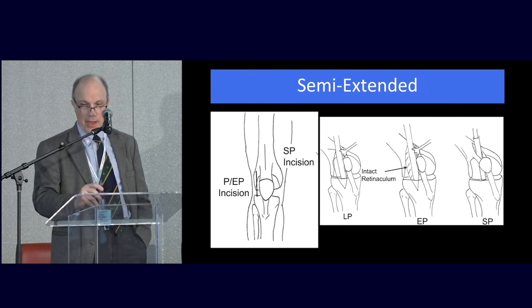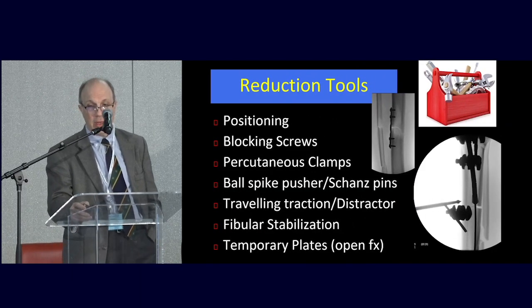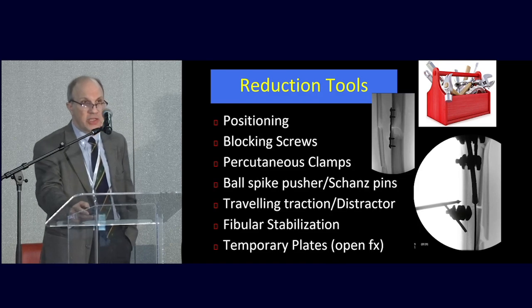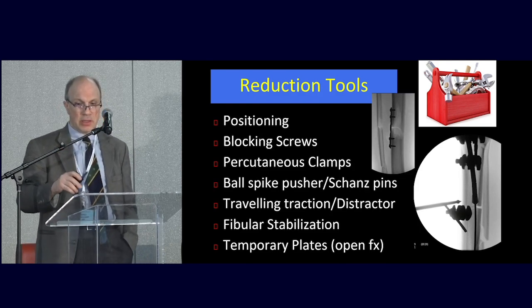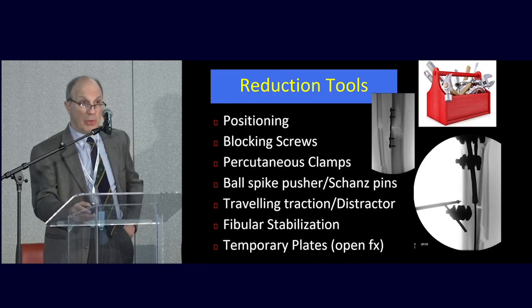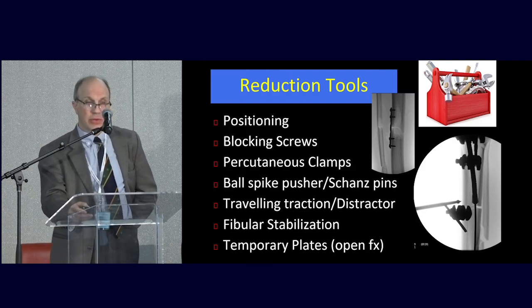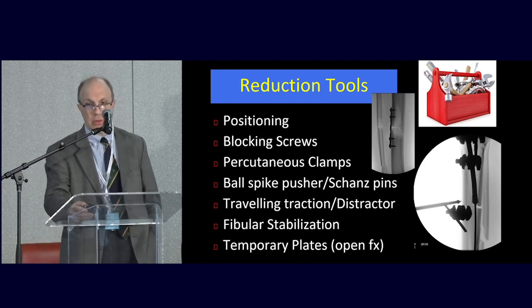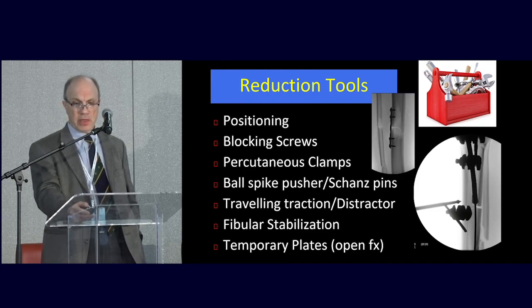Again, there are different types of semi-extended approaches. To fix tibia shaft fractures, you need to have all kinds of reduction tools, especially when it's not a middle-of-the-shaft isthmic fracture. You're going to need some of these tools, including the positioning. I think the semi-extended approaches made life easier for surgeons, especially private practice and community surgeons, who need to do these cases without much help, without trainees.